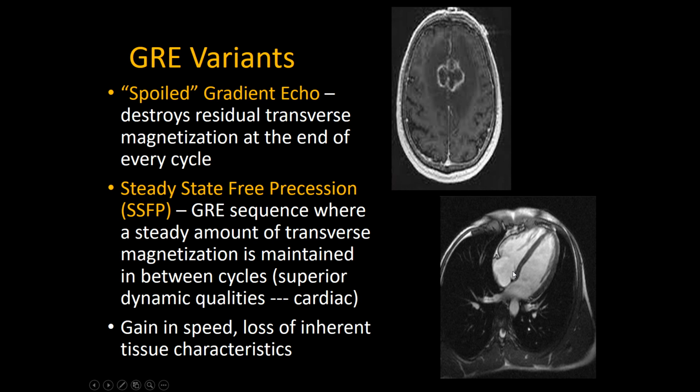But what you could do is look at it and see its movement. Like, is it protruding through the tricuspid valve plane during diastole and systole? So these sequences are used where speed is of utmost importance.